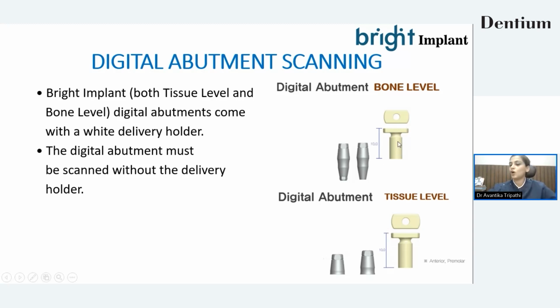This is not scannable. If any component is being scanned, that data should have a matching digital library. Then only we can process it digitally. If that component doesn't have a matching digital library, we cannot process it digitally. So this delivery holder cannot be scanned.